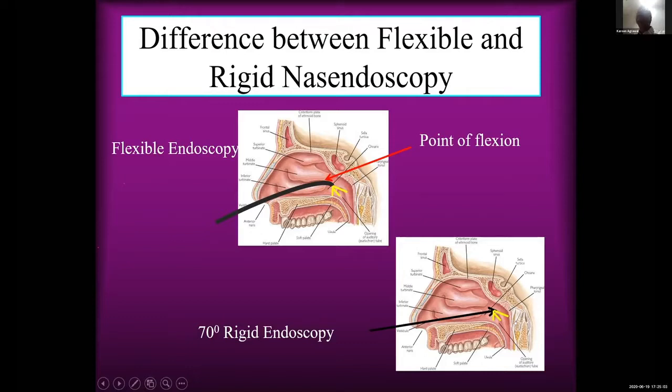It takes hardly 5 minutes for the procedure, but it requires little preparation by the SLP or assistant and counseling during the endoscopy, but it is not a very difficult procedure to perform. Now, this picture shows the difference between the flexible endoscope and the rigid one.